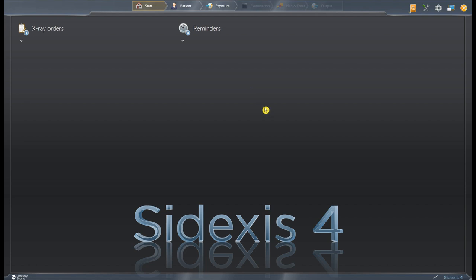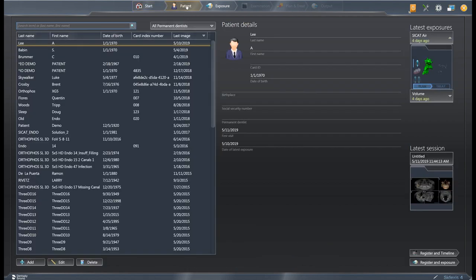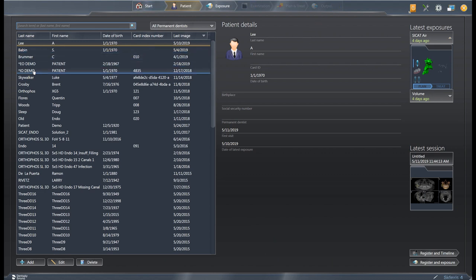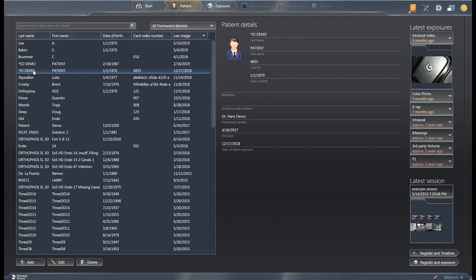So as we're looking at my screen here, Sodexis 4 is open. The first thing we're going to want to do is pick a patient up here on the top workflow bar. I'm going to use our IO demo patient and click on that and go to Register and Exposure, because this is what you would do if you are going to acquire an image.